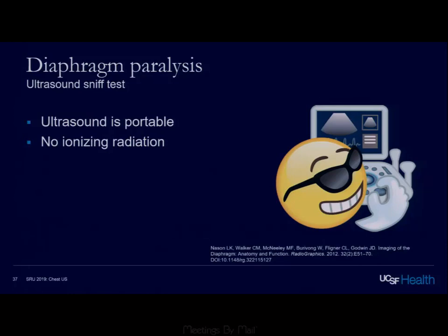So ultrasound has some advantages over fluoro. Ultrasound is portable and it has no ionizing radiation, so it might be really helpful for pediatric patients.